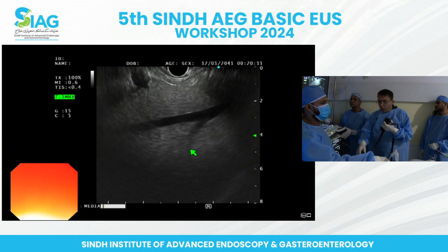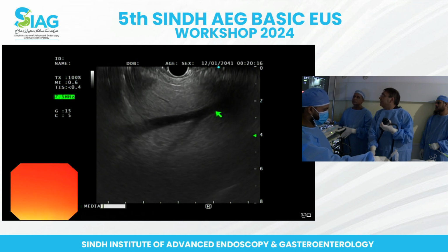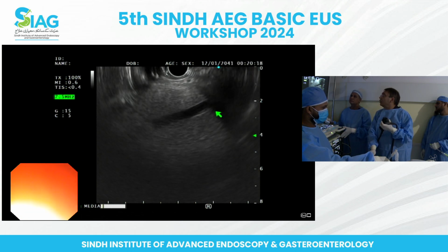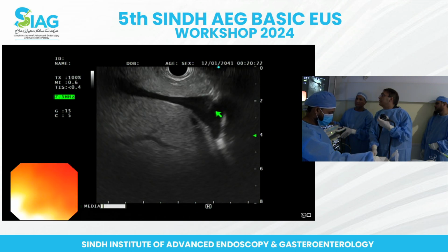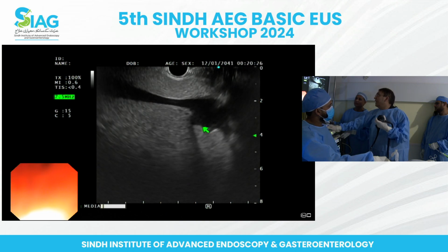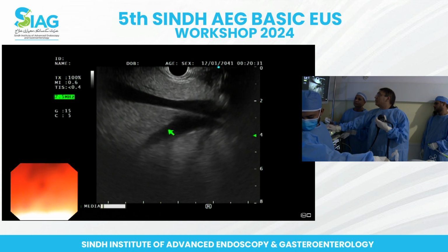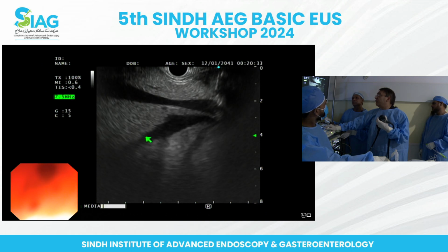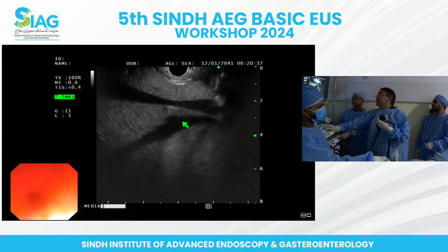Okay, I can follow this towards the IVC, and when I come close to the IVC, I'm going to see one more bigger, yeah, that's the IVC. You see that? And then I see another vein right here, which has a bigger trunk, but it tapers down as it further traverses through the liver. So that is the right hepatic vein.